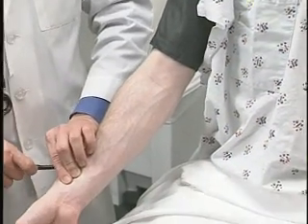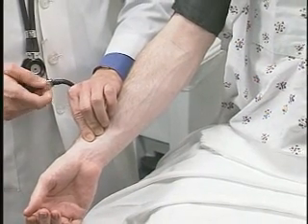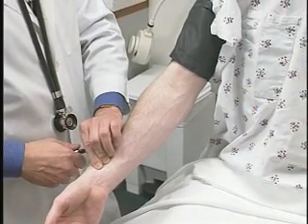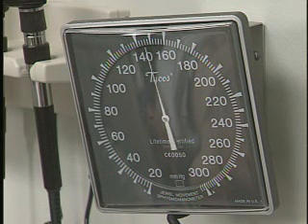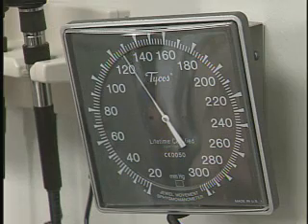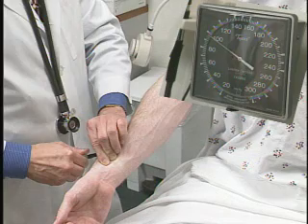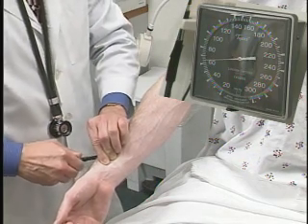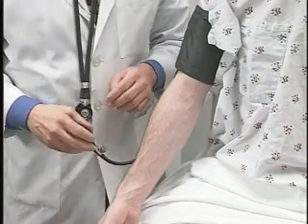Simply identify the radial pulse, tighten up the valve in the blood pressure cuff, and by watching the sphygmomanometer, I'm going to determine when I stop feeling the radial pulse and blow up the cuff approximately 20 beyond that. And I felt the pulse disappear at about 110. As I released the air from the cuff, I felt it return at about 110. This tells me that the systolic blood pressure is approximately 110.